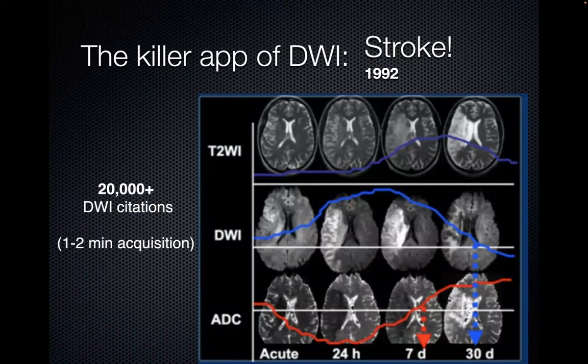My analogy to that is, imagine you had a satellite filming our streets, and the water molecules are cars driving around, right? As soon as you have a roadblock, an accident, maybe you don't know what's happening, but all the cars are driving around a phenomenon, an accident, an injury. Well, even though you have a satellite measuring big pixels on Earth, you can still pick it up because all the cars are doing the same thing. That's what's happening here.